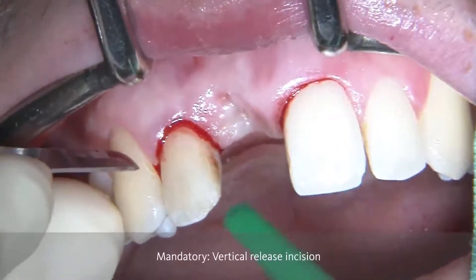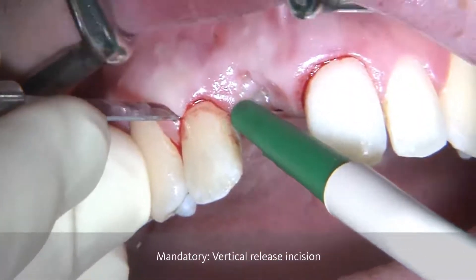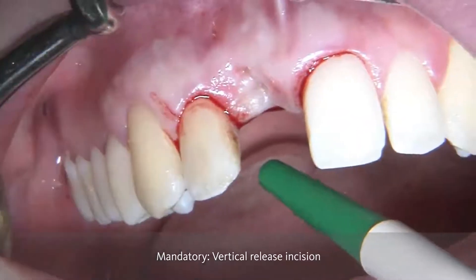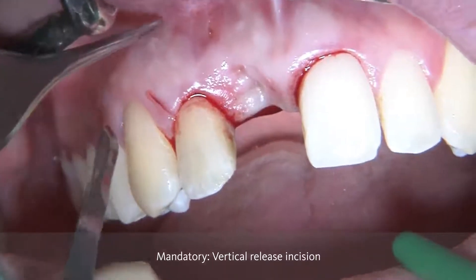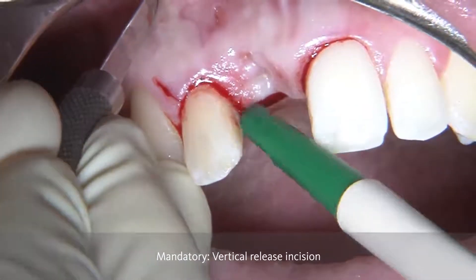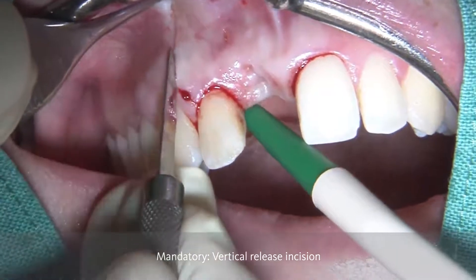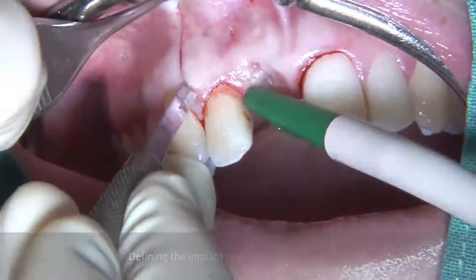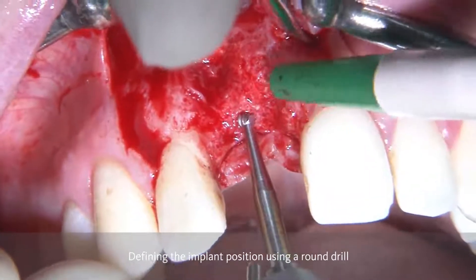It is only necessary to have one vertical releasing incision, which is going to be placed at the distal aspect, starting from the sulcus perpendicularly and then completing the vertical releasing incision by coming from the apical part towards the coronal part, touching the initial incision in this area. With this approach, we are able to have an ideal visibility of the area where the implant needs to be placed.